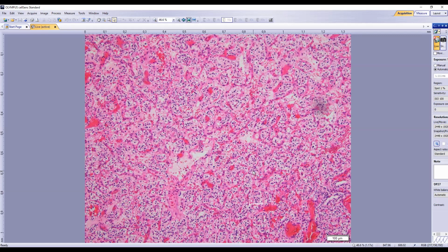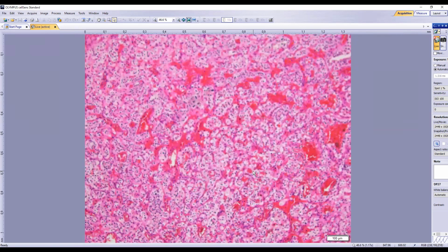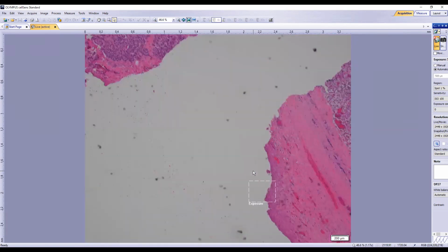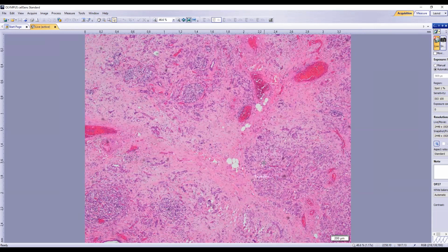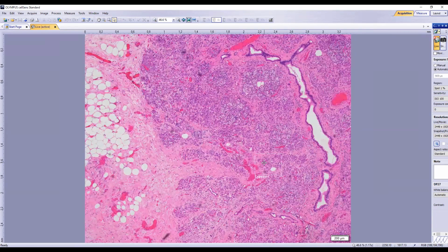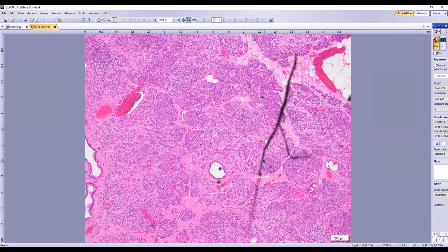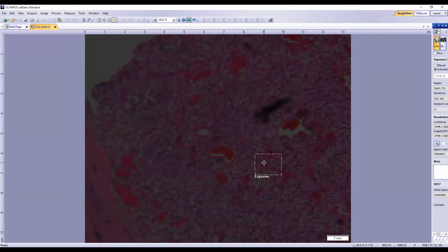Now this one is a fun one. 65-year-old male with a 4 centimeter lesion in the body of the pancreas. So I'm trying to see. So there is the pancreas. Background has chronic pancreatitis going on. There's the pancreatic duct. And then here is the lesion.